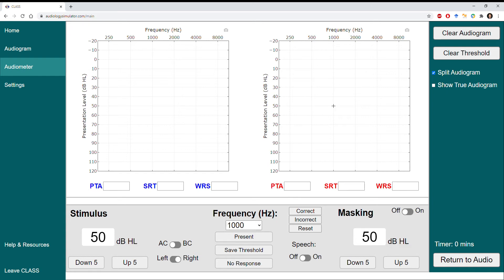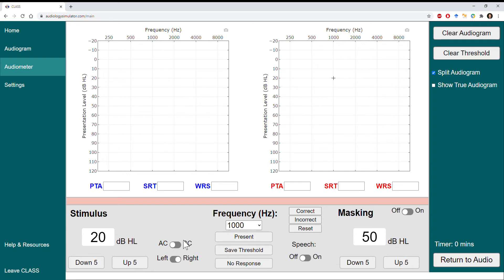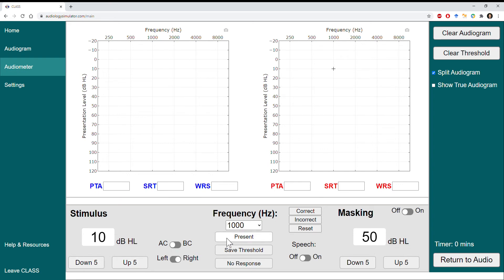I'll click 'Down 5' twice to go down 10 dB according to the modified Hughson-Westlake procedure and then present the stimulus again. I see that the patient responded, so we'll continue to decrease by 10 dB until we find a level where we do not get a response. Once we find that level, we know that we are below the patient's true threshold.